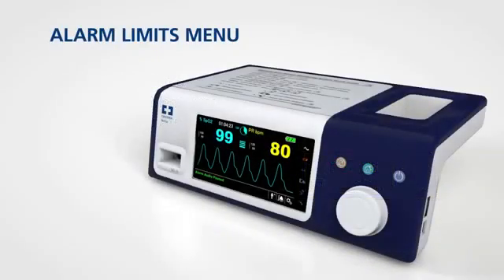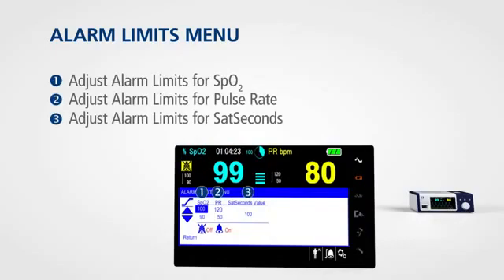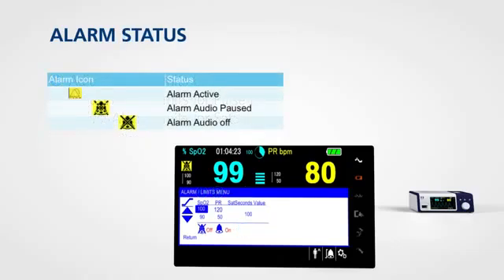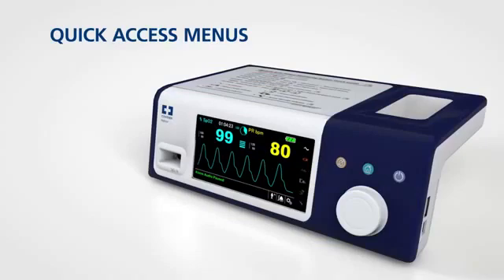To access the alarm limits menu, rotate the jog dial to highlight the alarm limits display area and press. From this menu, you can adjust the alarm limits for SPO2, pulse rate, and sat seconds. The alarm limits menu also allows you to silence audible alarms until the next power cycle. Colour icons show alarm status at a glance, and for quick access to alarm settings, rotate the jog dial to highlight one of the two areas and press.